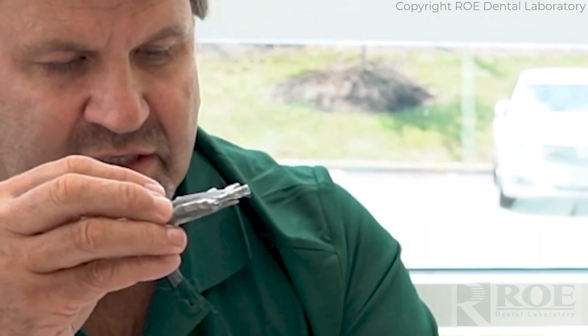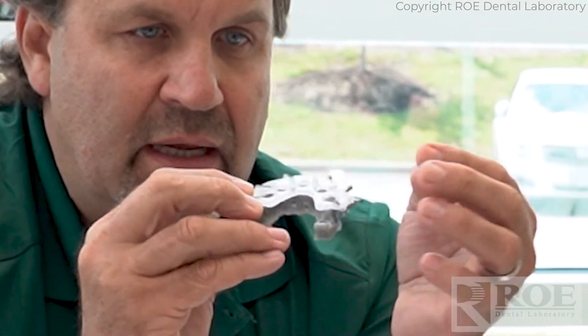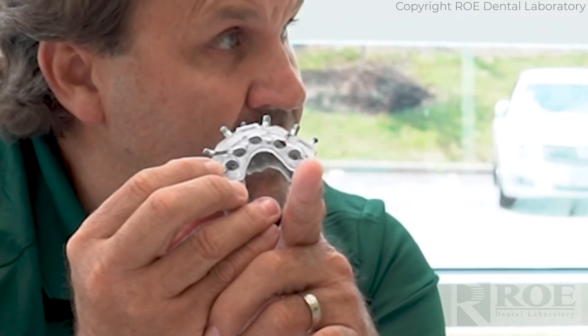That tells you where to stop rotating. Now if for some reason you're taking a little bit more bone away on the osteotomy and you feel you want to go deeper, we have the carrier guide that has the timing on it as well. You can place your abutment through this, screw it down, and make sure it seats 100%. The black line follows the screw that goes through the abutment and into the implant — that's the trajectory of the abutment screw and the direction your driver needs to go.